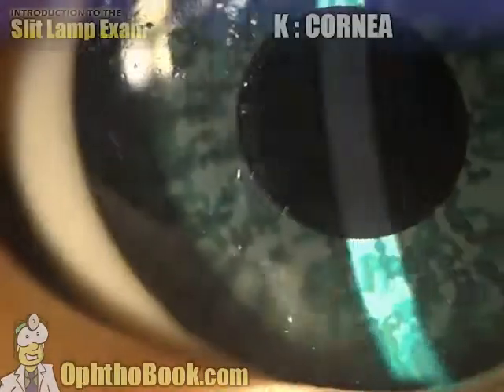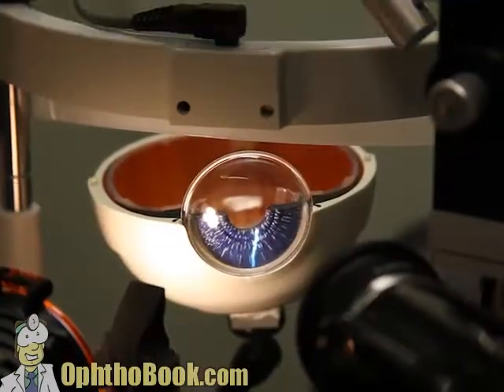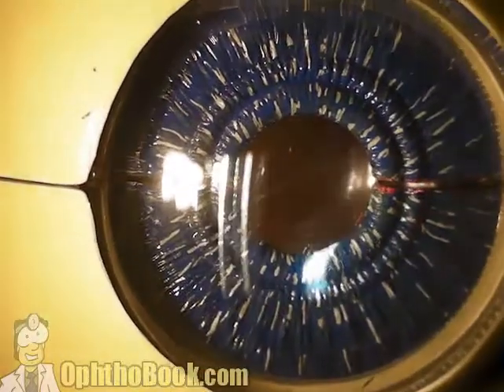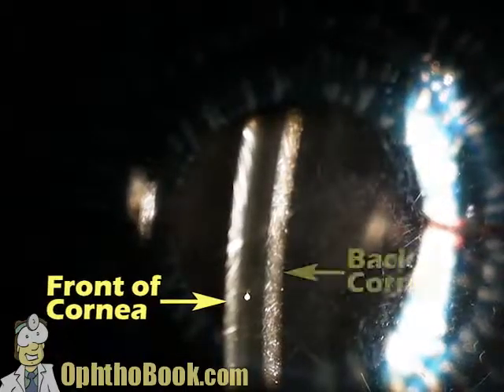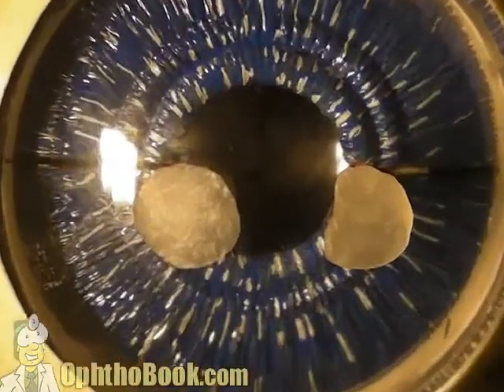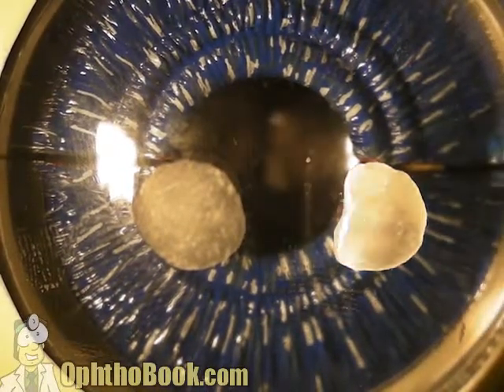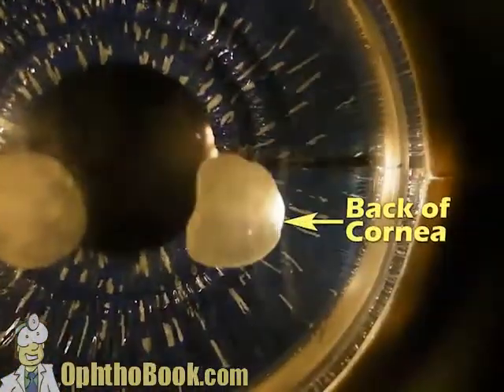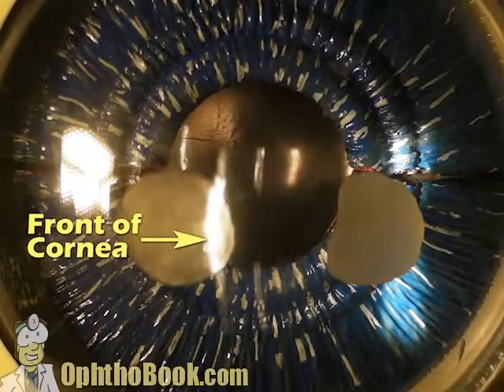Then we move on to the cornea — that clear window in the front part of the eye. Clear structures like the cornea are really where the slit lamp comes of age, because you can get a cross-sectional beam and look at that cornea in fine detail. With the beam coming in from the left, you can see the front of the cornea, the back of the cornea, and the middle part. This cross-section lets you track down lesions — whether they're on the outside or inside of the cornea — using the slit beam to tell their depth and location.